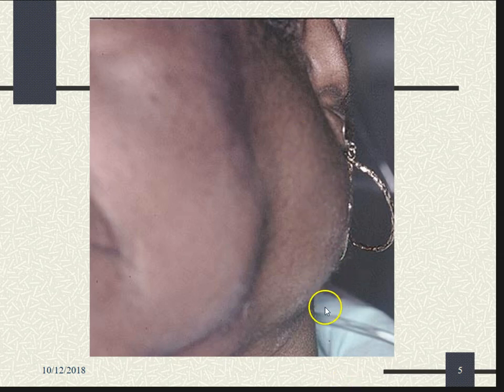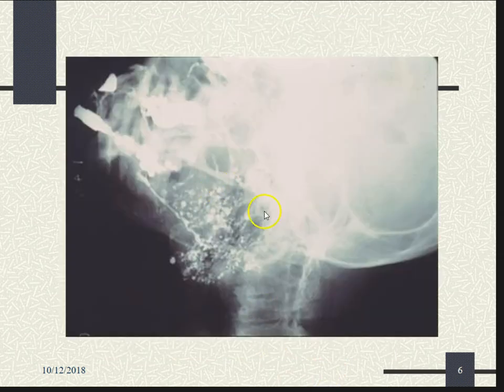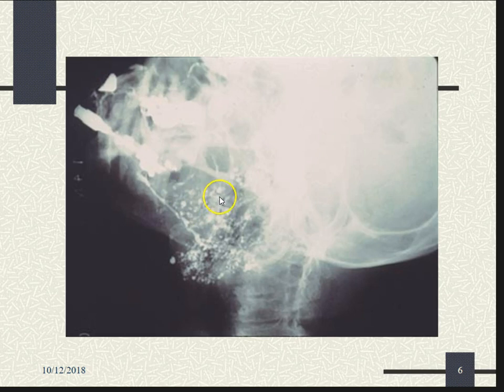Here's an example of somebody with a really swollen parotid gland on one side. This is what the parotid gland looks like once the contrast has been injected. It's like a cluster of little balls because the salivary glands are not just a hollow pocket — they're composed of little subunits that look like clusters of grapes. That's where the saliva is generated, and it all joins together, ultimately going through the duct and into your mouth.